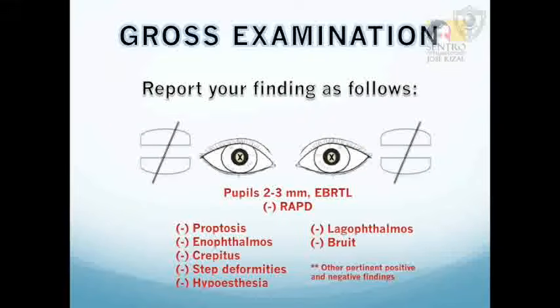Report your gross examination findings as shown. Always note the pupillary reaction and the presence or absence of RAPD. Also note all pertinent positive or negative findings.